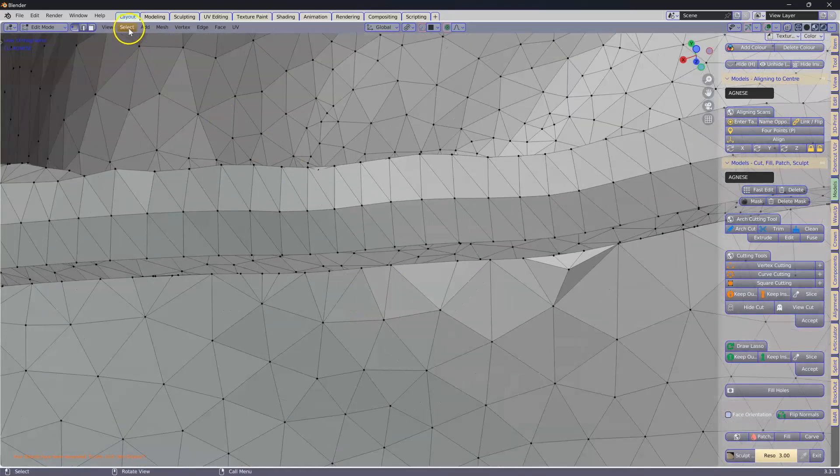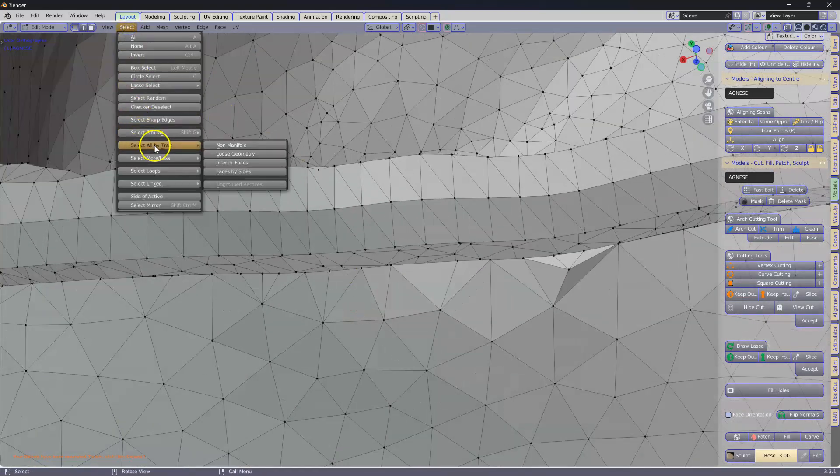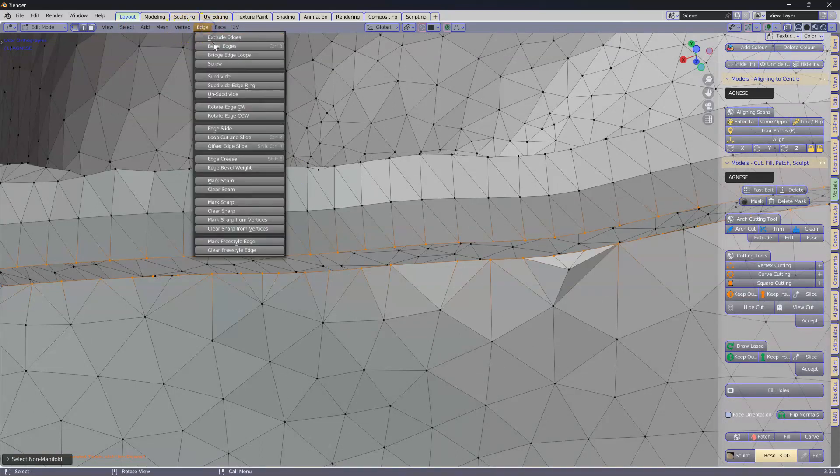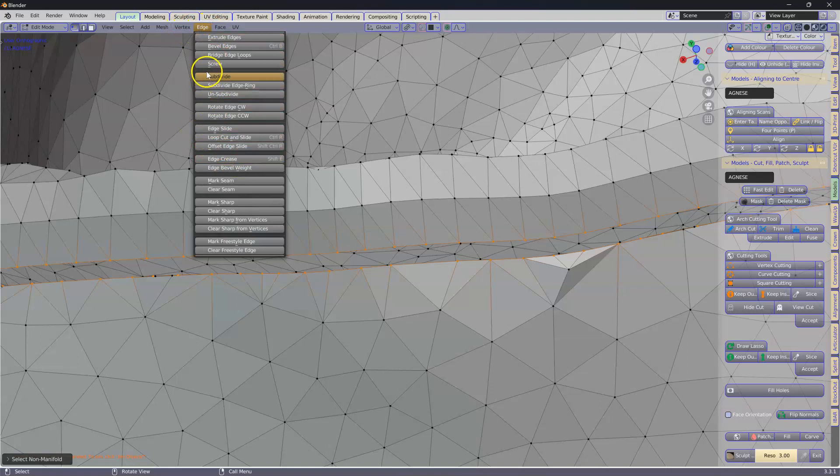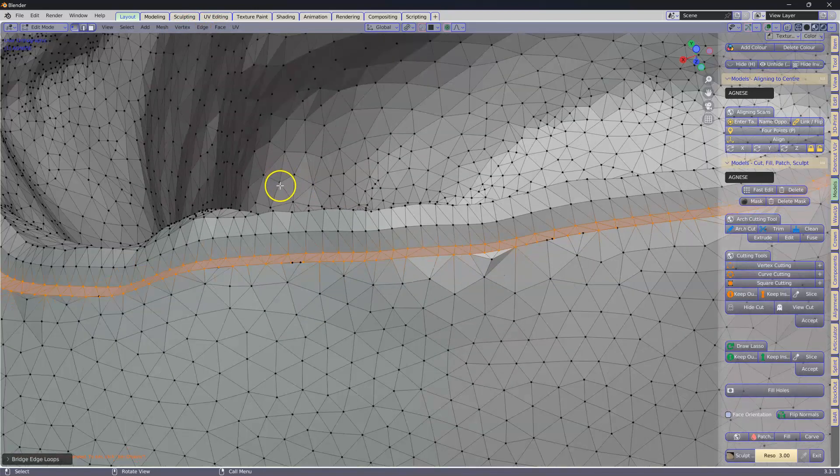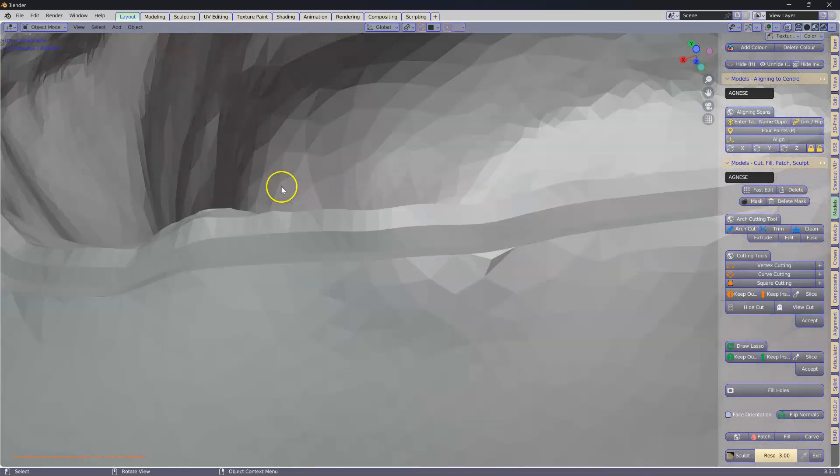Select all by trait, non-manifold. We're going to go edges and bridge edge loops. That's fixed the problem. Tab to get out of it.